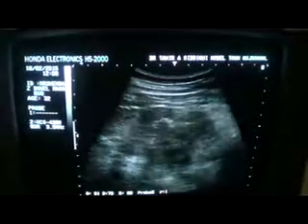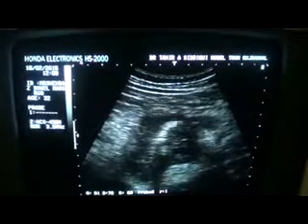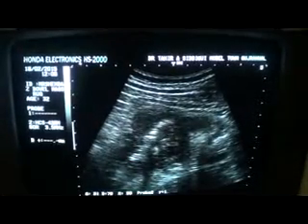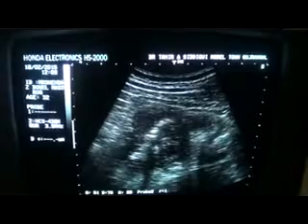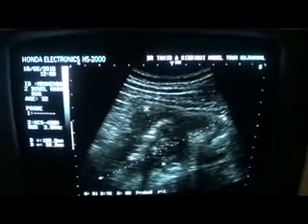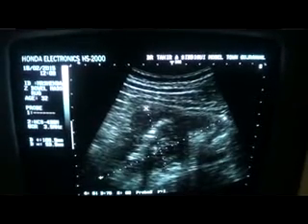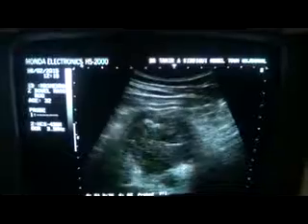Both ends are abrupt. Lobulation is seen. This is the medial end, this is the lateral end. See the lobulation, and this is the trapped air in the lumen. I'm going to mark it for you, the bowel mass in longitudinal section, extending from the right upper quadrant down up to the para-umbilical region. This is the transverse section of the same.